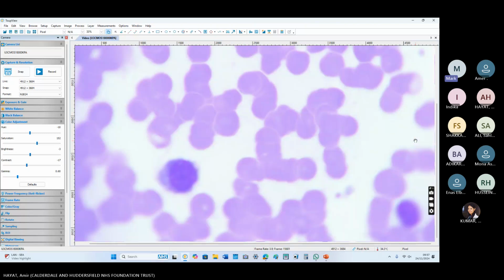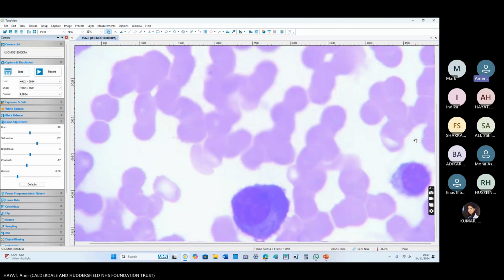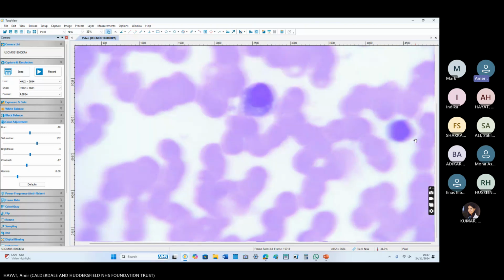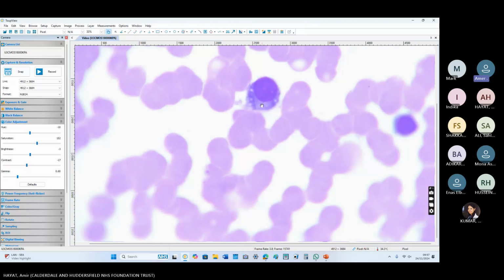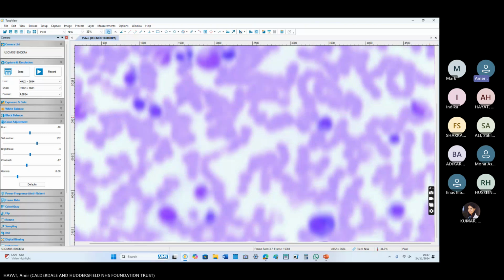Yeah, those are bodies. And there was another term as well, because one of them is intranuclear and another is intracytoplasmic. Those are the features of Waldenstrom, not commonly seen in multiple myeloma patients.